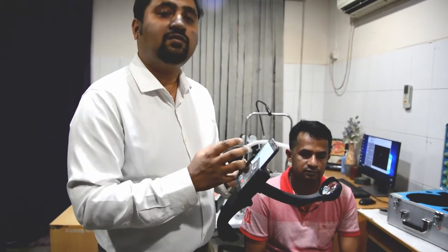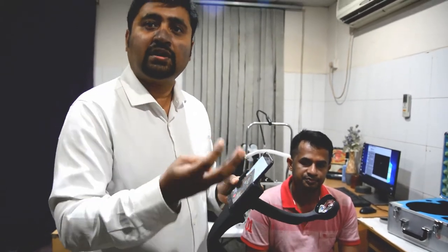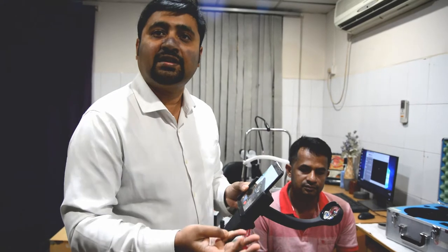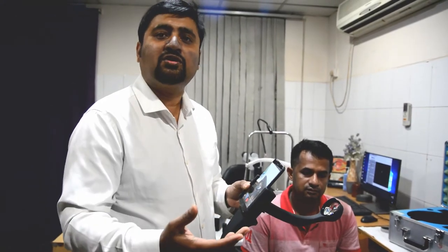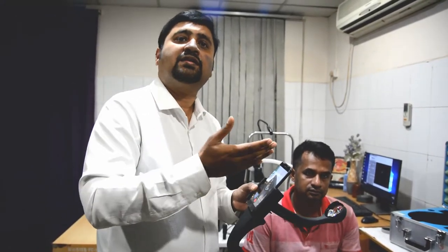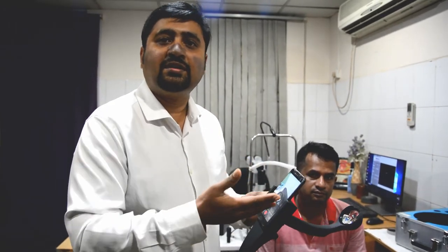In this mobile phone, you can use WhatsApp, Messenger, Viber. Yes, in this email, the condition is centrally managed and the patient's treatment is carried out.